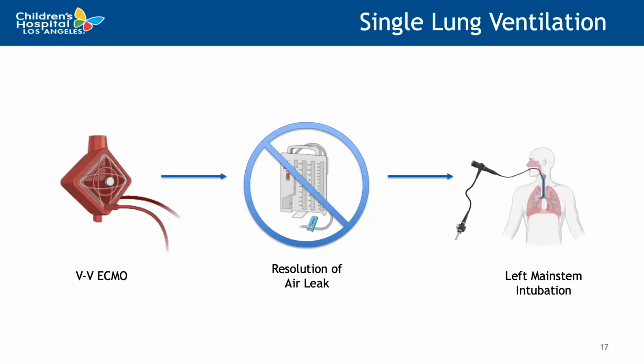So ultimately, the patient was selectively intubated while on ECMO. So we had the ECMO circuit doing most of the oxygenation and ventilation. And so via the bronchoscopy, we were able to place the endotracheal tube into the left mainstem bronchus, allowing for full healing of the right side.